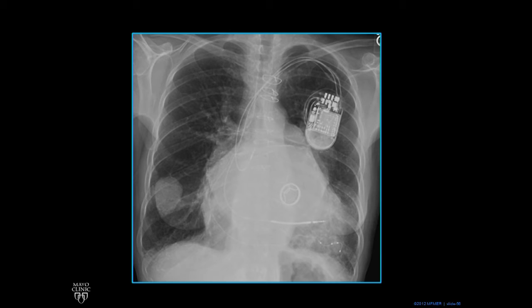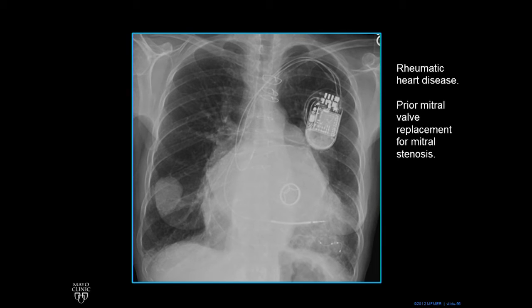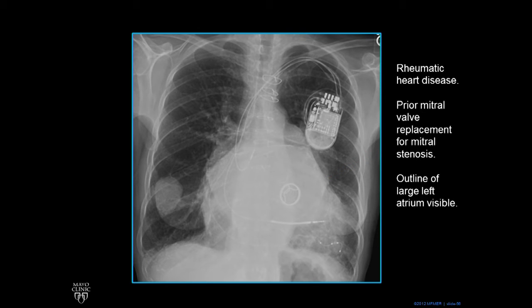Here's a new chest x-ray — this one is not normal. This patient had rheumatic heart disease, which gives you an autoimmune reaction to your cardiac valves. She had a prior mitral valve replacement for mitral stenosis. This metal thing is a mitral valve — the valve between the left atrium and the left ventricle — which has been replaced and it's mechanical. In this case, you can see the outline of the left atrium, which is not normal because this left atrium is very big.